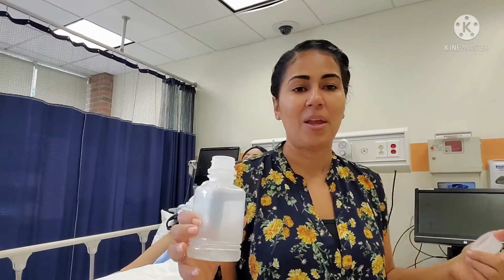Now, what does that do? Well, this is what's so cool about nursing. Remember when we looked at the water seal? It allows the air or whatever drainage that needs to come out to drain, okay? However, it doesn't allow air to go back in. That's what the water seal does. Well, this is what this does too. So I'm going to put the patient's chest tube into my sterile water, because that's going to create my water seal to prevent air from going into my patient's lung, because I don't want to cause a pneumothorax while my colleague is getting me a new drainage system, okay?